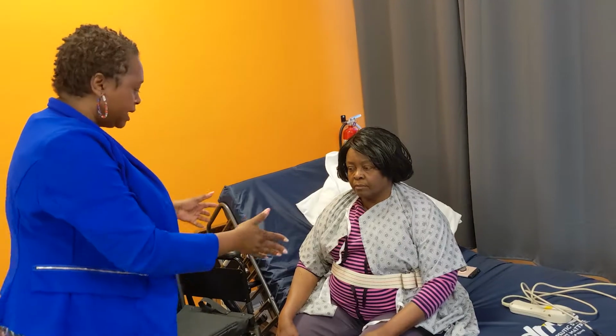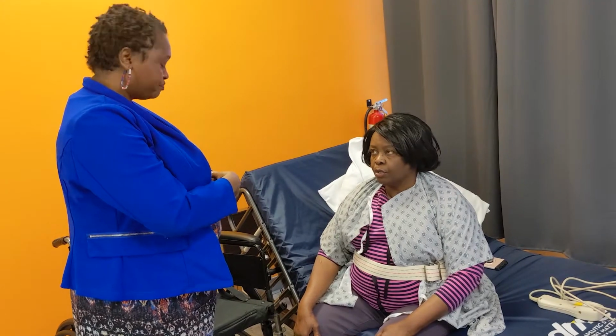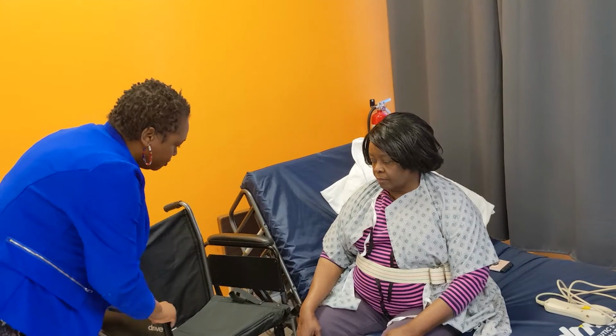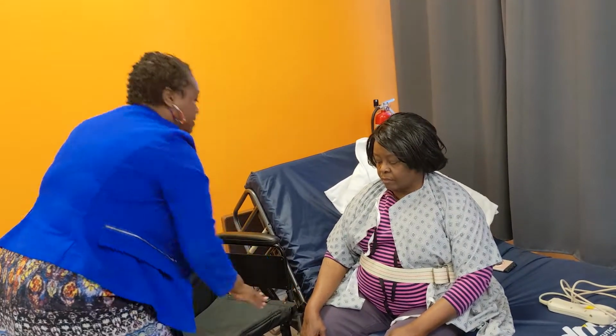So now I do take a moment. It's probably been about 2 to 3 minutes. I ask, do you feel dizzy or lightheaded? No. Okay. So now I know I locked it. I'm going to get it a little bit closer. Make sure I just take a second moment to make sure it's locked again.